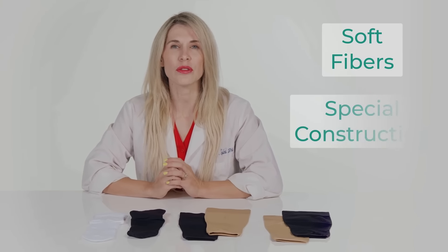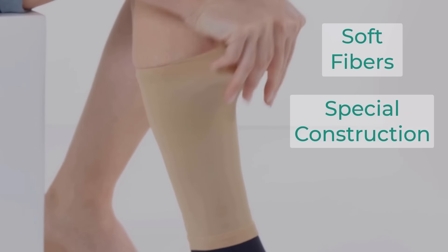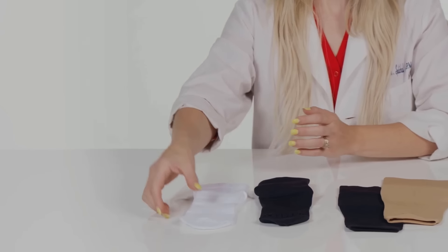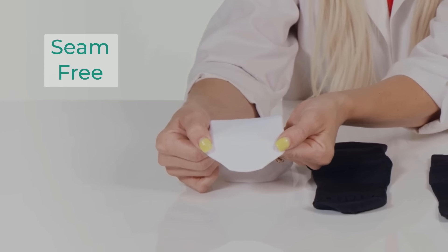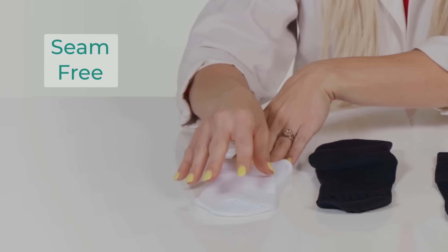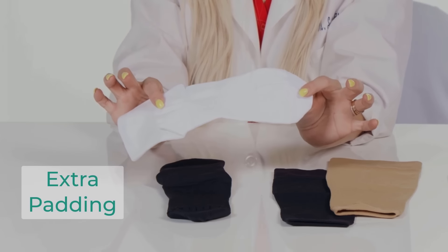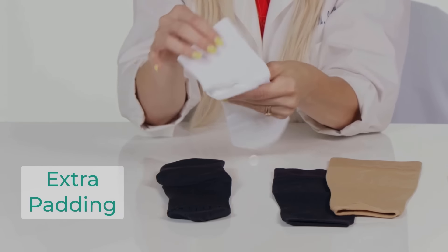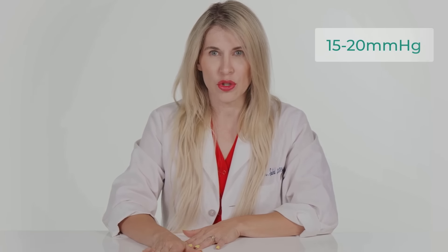The socks are made from soft fibers and a special construction that makes them stretchy and very gentle against the skin. The toe area is seam-free to enhance comfort and eliminate irritation. The ankle socks are constructed with extra padding in the ball of the foot and the bottom and back of the heel for extra comfort and protection.